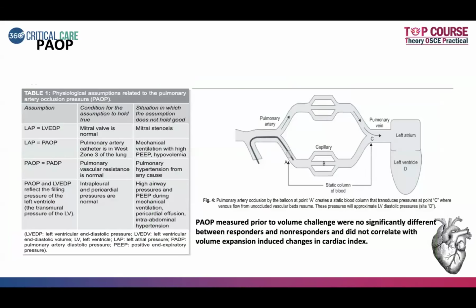Coming on to pulmonary artery occlusion pressure. As I told you, we are assuming many things. So what is the goal here? We are inserting a catheter into the pulmonary artery, and we are assuming that the pulmonary artery catheter is in West zone 3 of the lung, and we are occluding that particular point, and we are presuming that the mitral valve is normal. So whatever pressure is reflected from the left side of the heart at that particular point gives us the function of the left side of the heart.